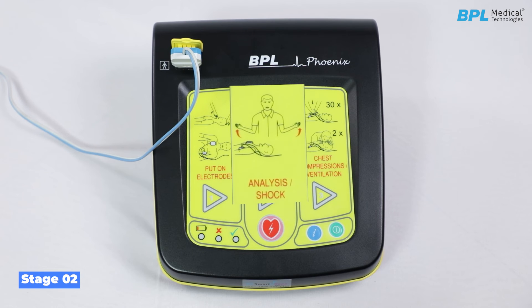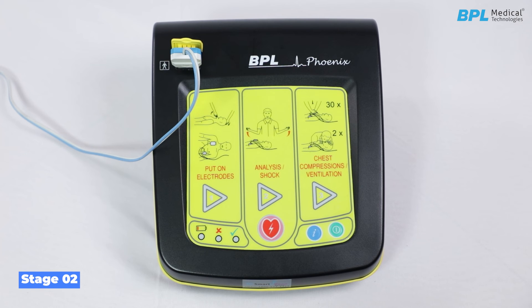Stage 2: analysis or shock. After detecting attachment of the electrode, the device is now in stage 2. The workflow triangle LED 2 lights up. The following voice prompts are heard: do not touch the patient from now on. Please wait. Heart rhythm is being analysed.